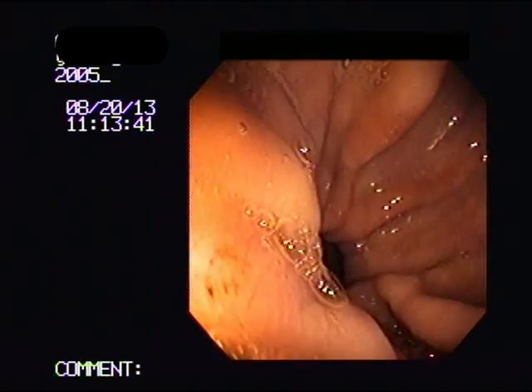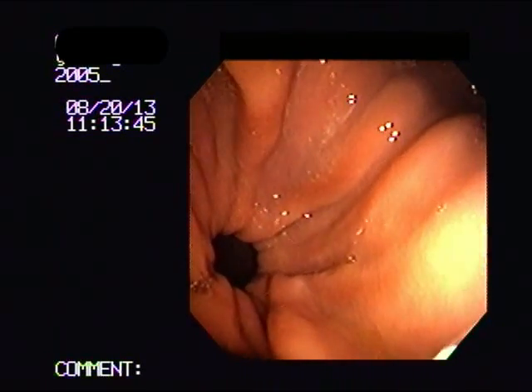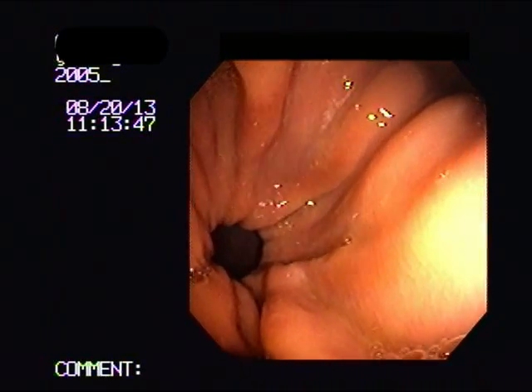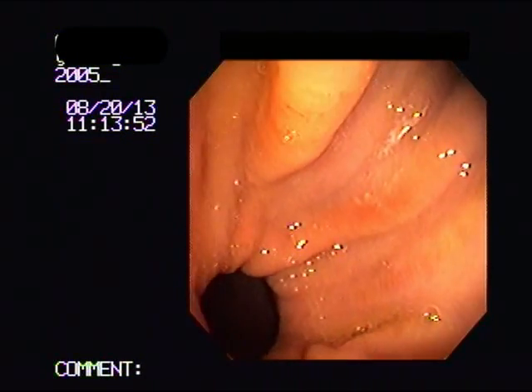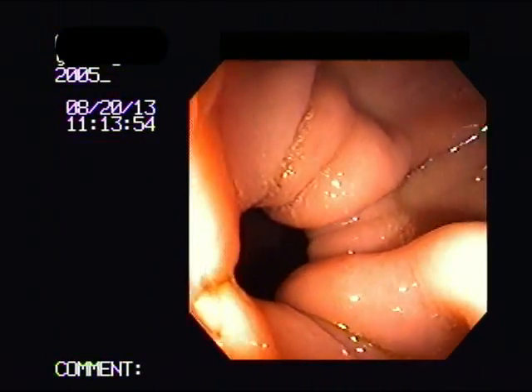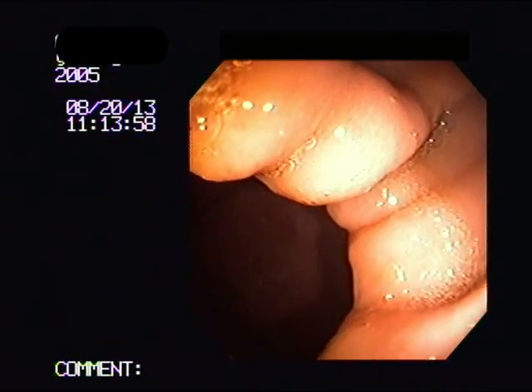We're going to see it coming right into view — there's that hole in there. We observe the pylorus from the stomach side to see whether there is any ulceration. In this case that's completely clean. We also look for motility to make sure that it's able to contract, as it is doing right now, and open up again.